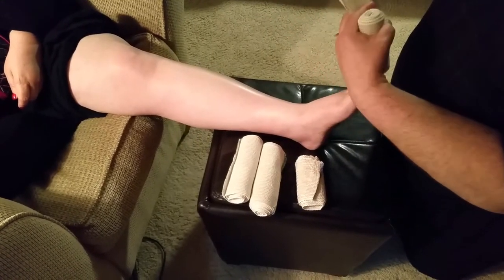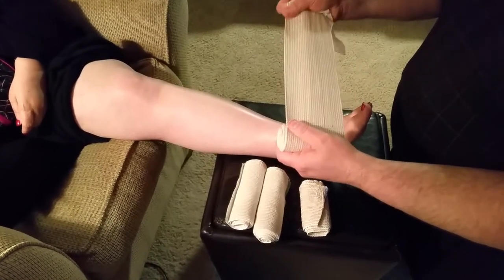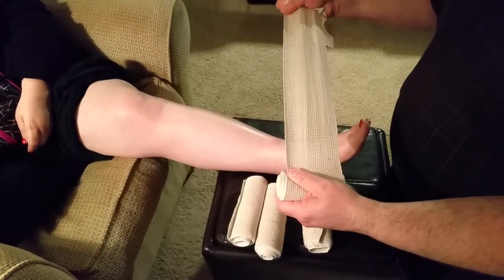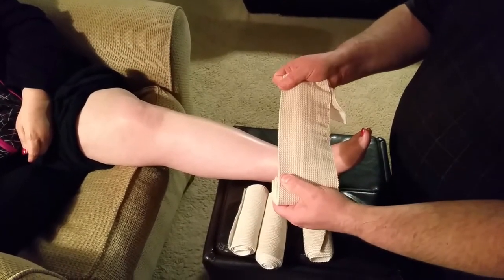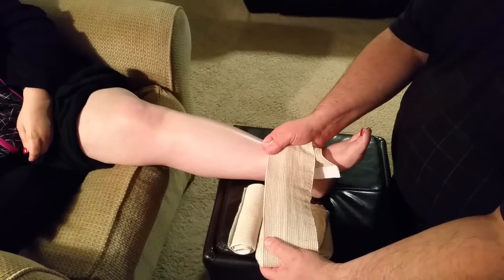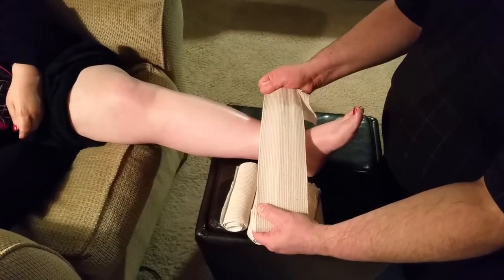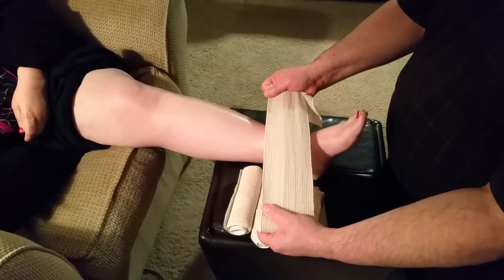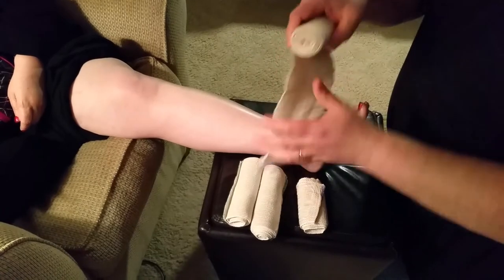This part doesn't really have stretch anymore, so we'll use this one to illustrate. If I stretch it all the way out and then come back halfway, that's 50% stretch — that's about how tight I want to wrap it.